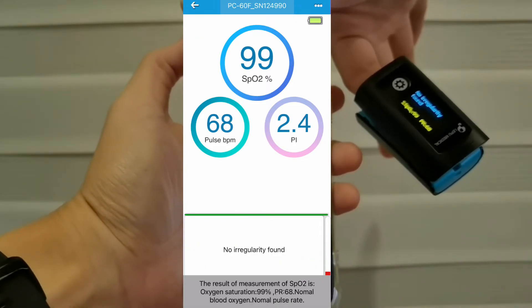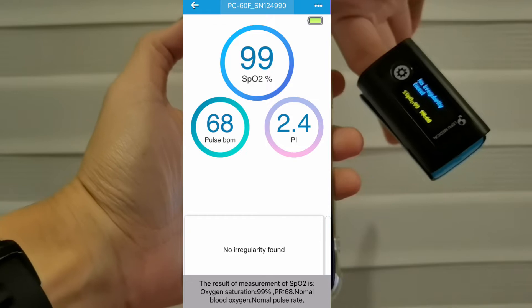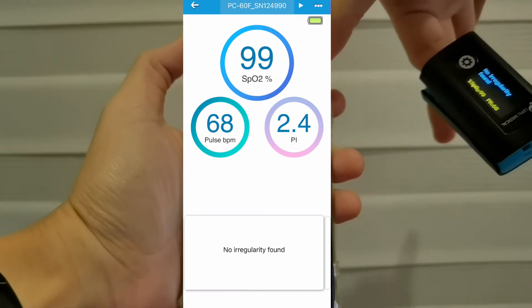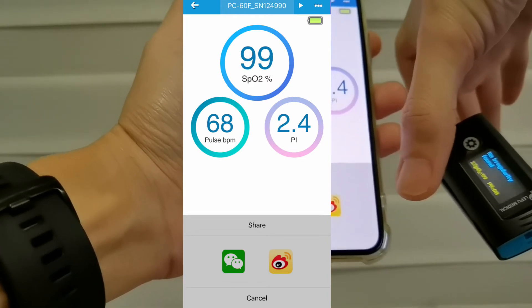The result of measurement shows SpO2 — oxygen saturation — at 99%, pulse rate 68, normal blood oxygen, normal pulse rate. From here you can also share with WeChat or Weibo.